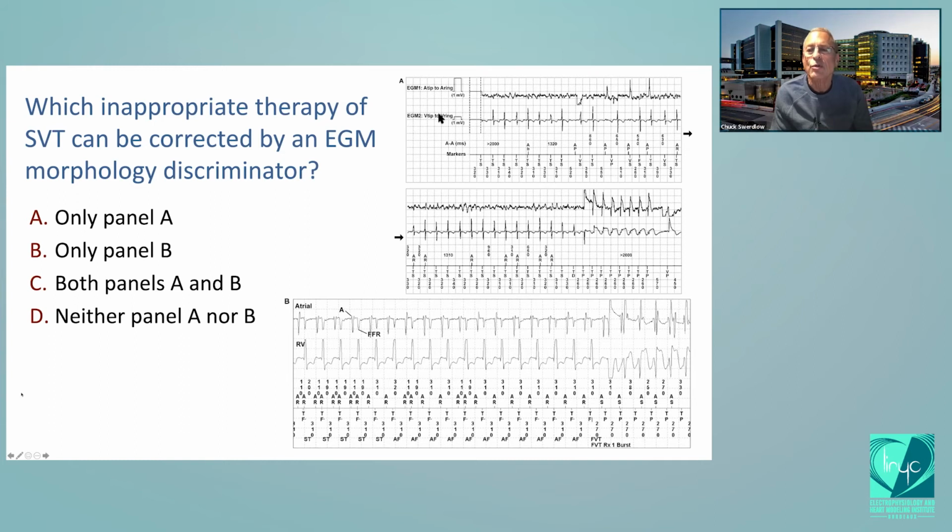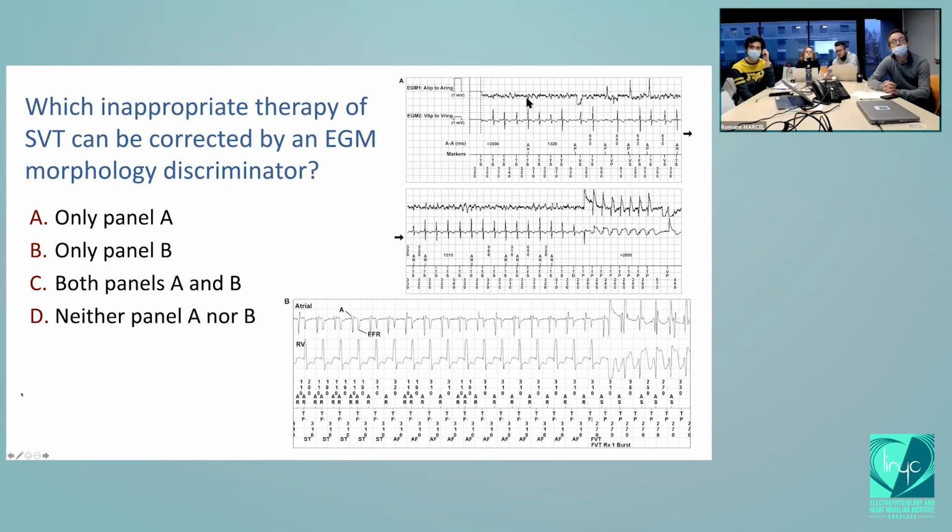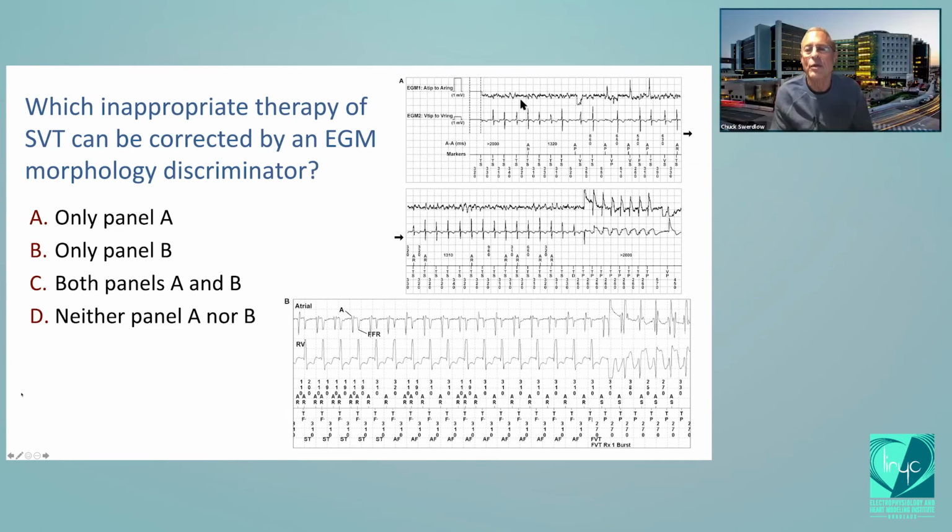Well, let's work through it. What's going on in the atrium up here? Is sensing appropriate? Is there oversensing or undersensing? Here's the marker channel. There's an atrial marker channel on top, and we want you to pay attention to it. Compared to all the ventricular electrograms, are there as many markers, too many markers, or too few markers?